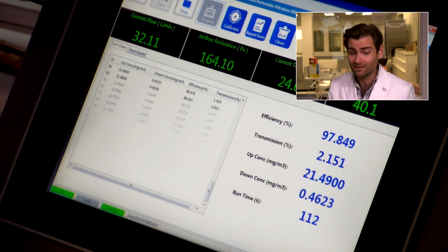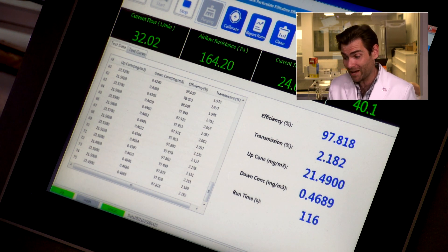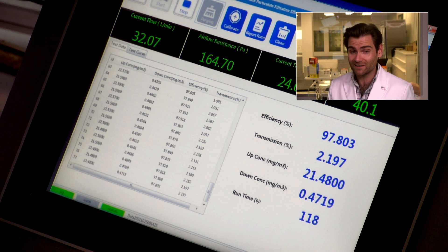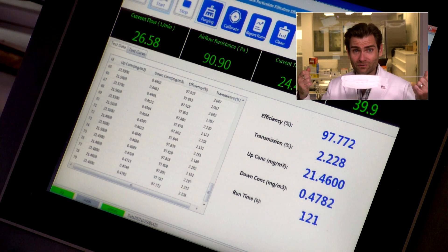So I'd probably choose a different mask. I mean, they're supposed to be 15% better — so come on. But at the same time, the smell wasn't that bad. Very strong ear loops, so your mileage may vary on that.